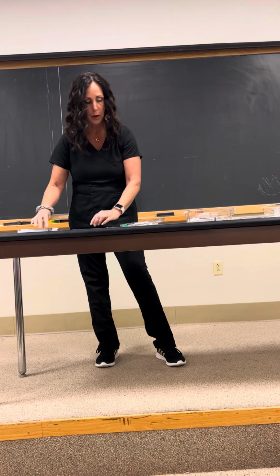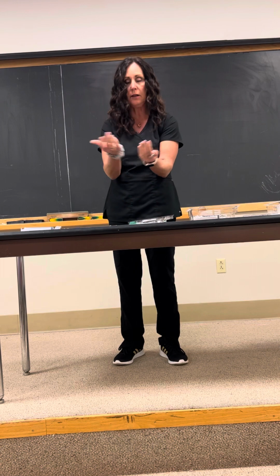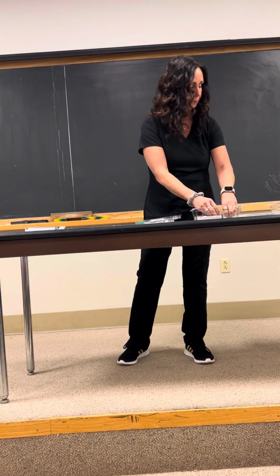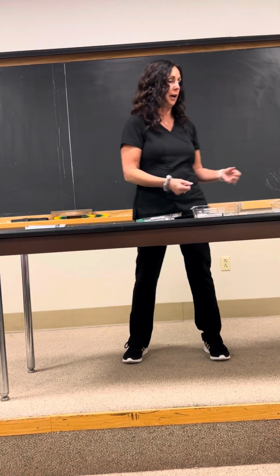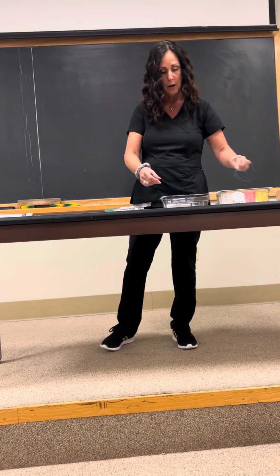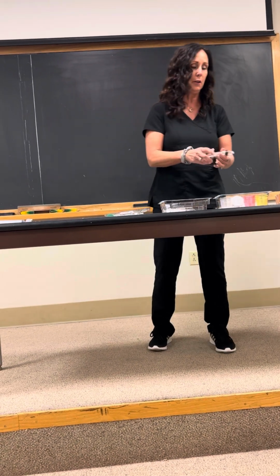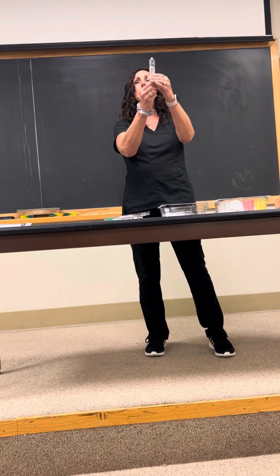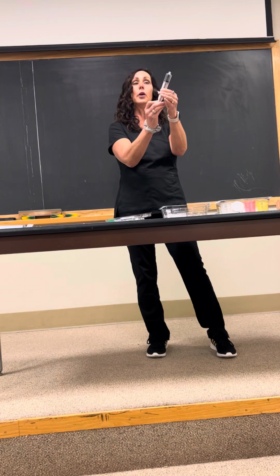And then what we're going to do is have heparin again decanted onto the field. There are sterile caps. I guess they don't use the sterile caps, so you can get rid of those. But again, everything needs to be flushed with heparin that's going to come in contact with the marrow. So heparin's going to get decanted into one of these sterile cups. All you're going to do is take your two 30 ml syringes, draw up your heparin, and just go back and forth a couple of times by pulling back the plunger, just to make sure that the syringe gets well coated with heparin.